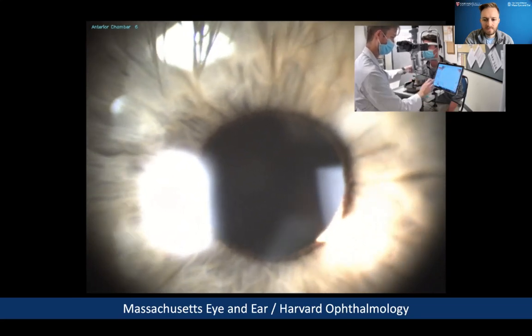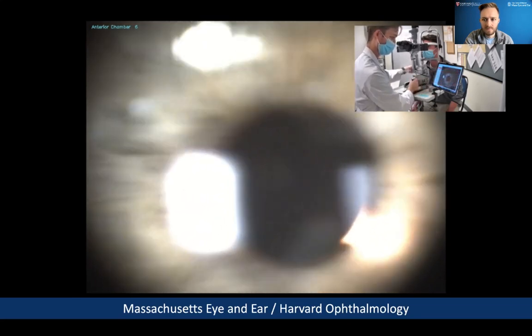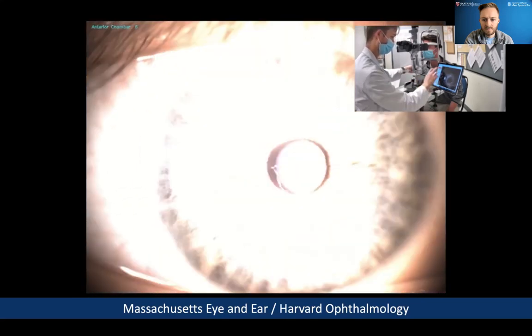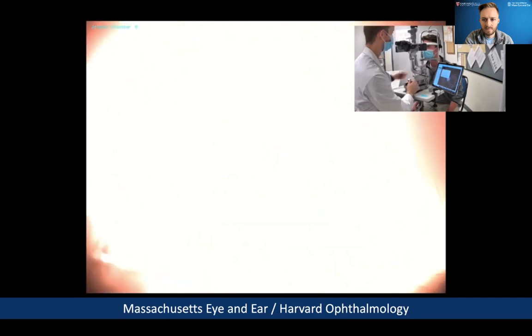As we change the light source, and as we move to different portions of the eye, you'll notice that if we don't change the buttons, the exposure becomes over or underexposed.